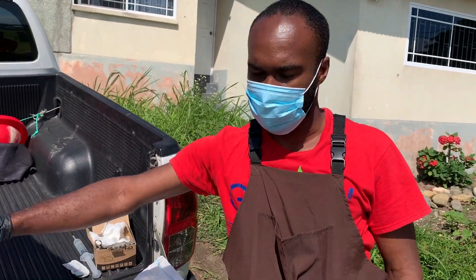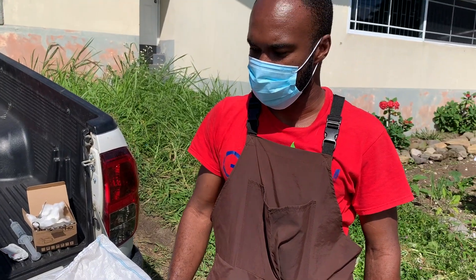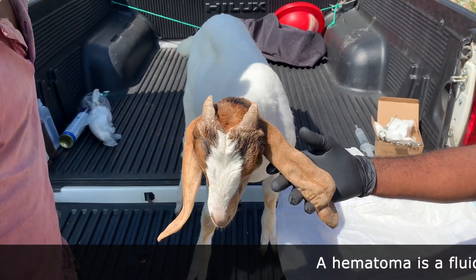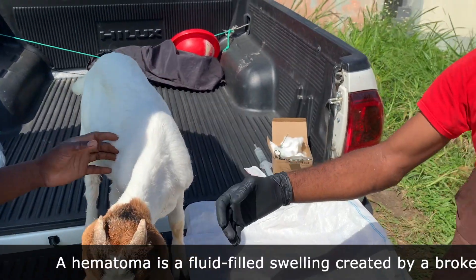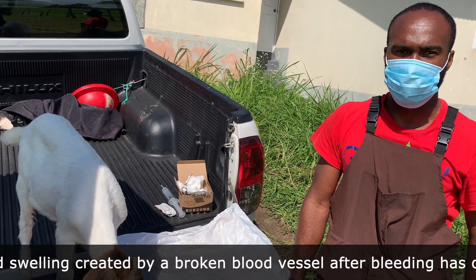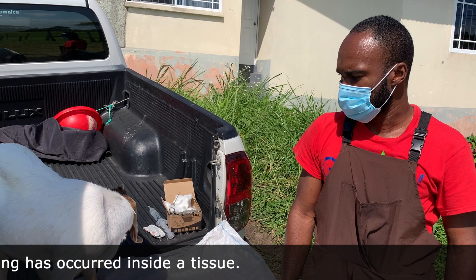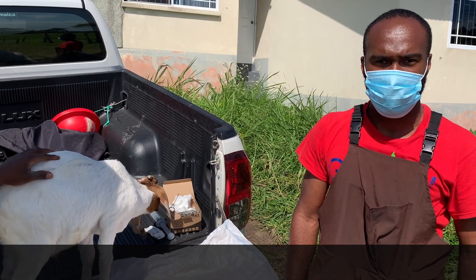We have this lovely kid here — a special boy, a nice weaner — but unfortunately he has what we call an aural hematoma. Pretty much it's a swelling of the ear due to the capillaries, the micro vessels in the ear, rupturing and causing blood and other fluid to accumulate. So I'm going to perform a little mini surgery and tweak the procedure a little bit. Ideally he should be sedated, but he ate some food, so we're going to navigate that and get him sorted out.